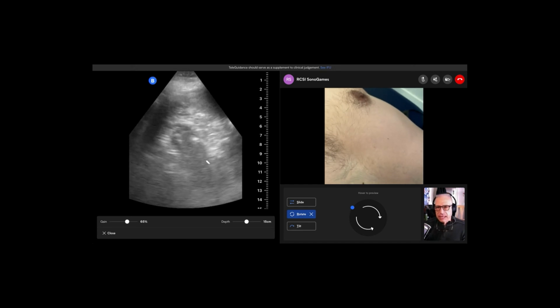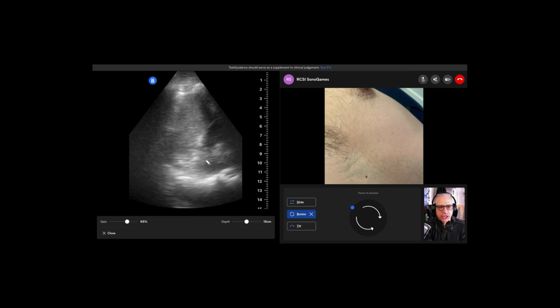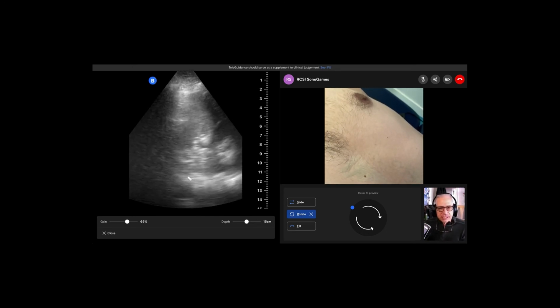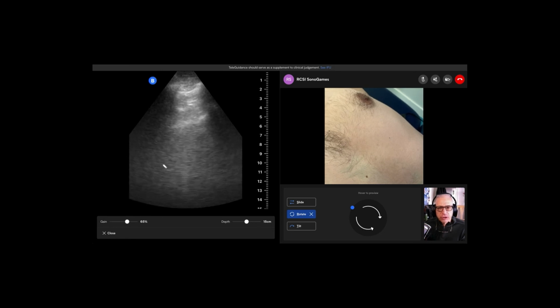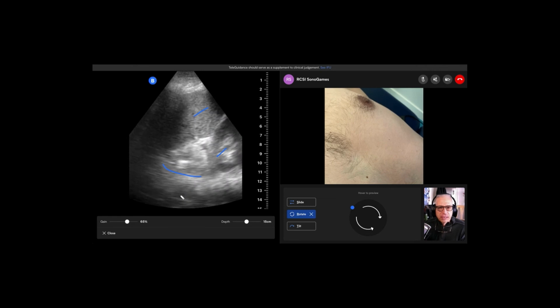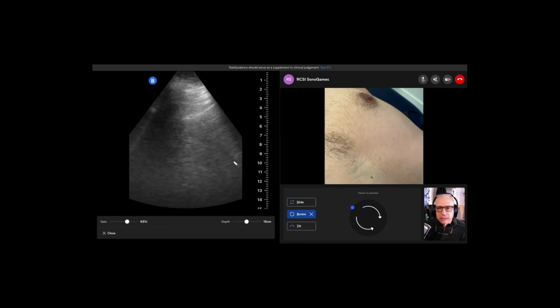And so as you see, when he breathes, it ruins the image. So if you have him on a vent, you can shut the vent off. Right there. That's fantastic. When this lung excursion goes away, there's a beautiful view of kidney, spleen, diaphragm. Negative. Nice. No blood, really good. That was really nice.